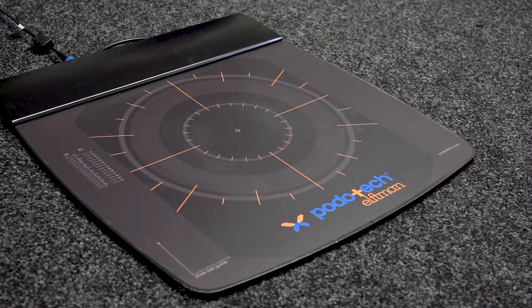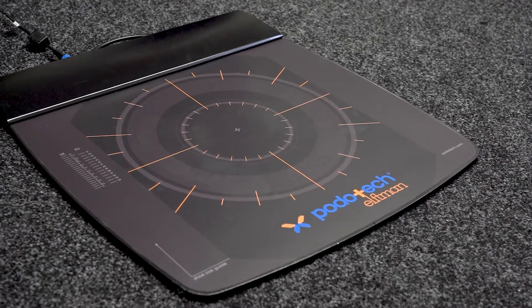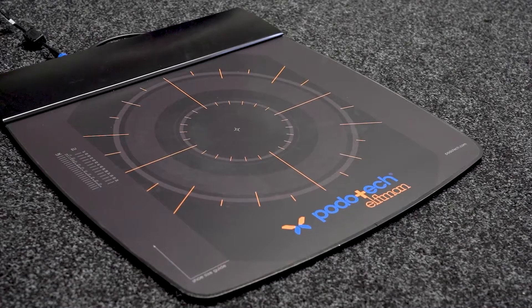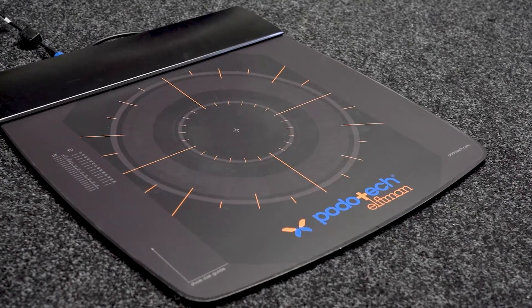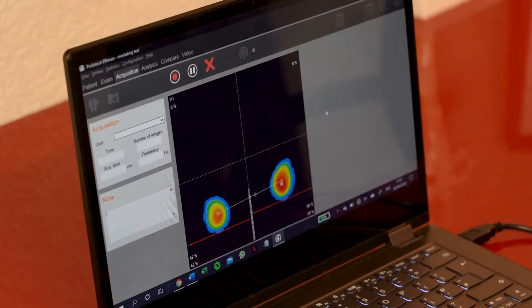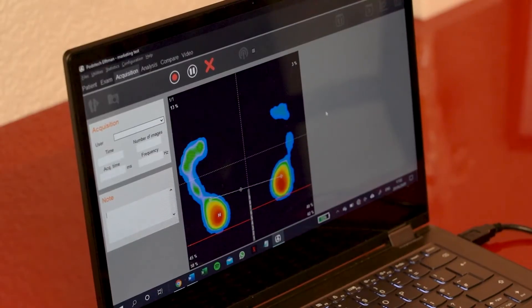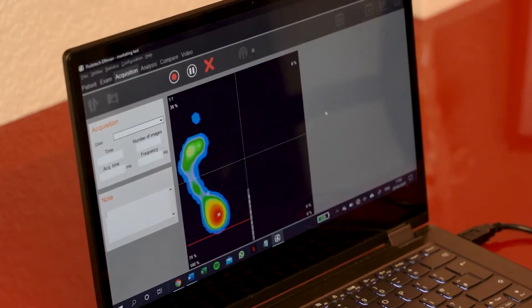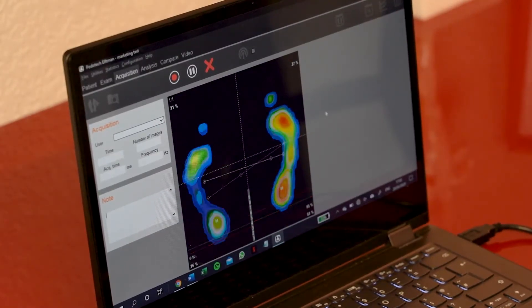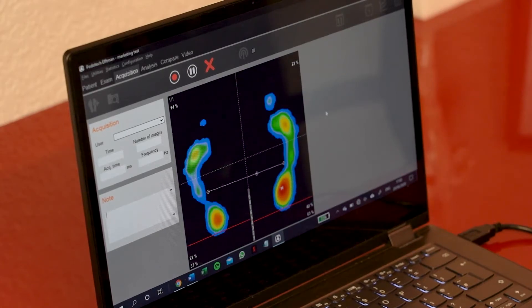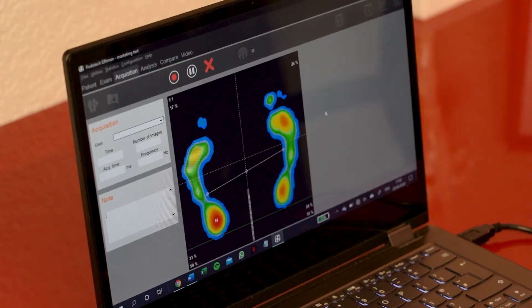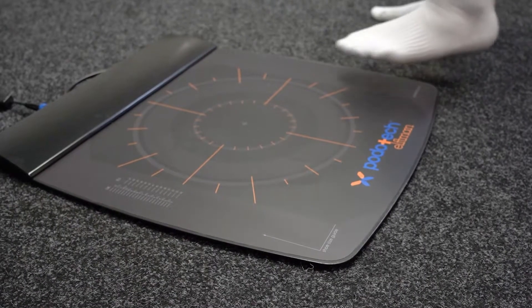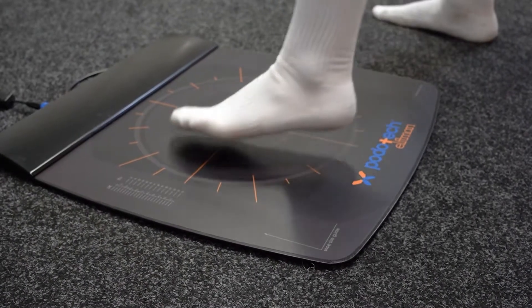The pressure plate takes 100 images of the bottom of your foot per second. We can use these images to treat current injury and identify factors that may predispose you to injury in the future. The plate offers three types of measurement.